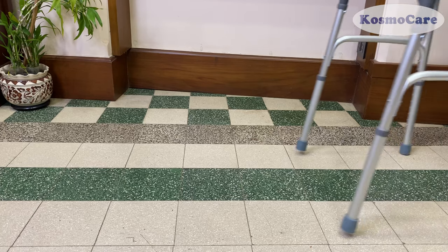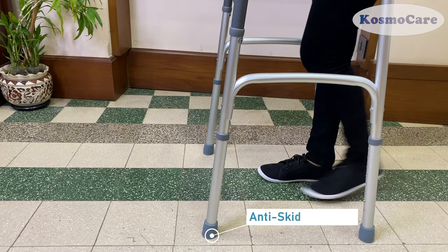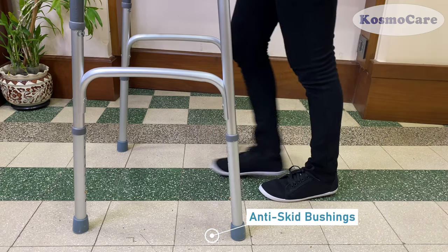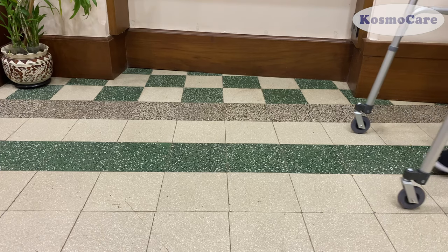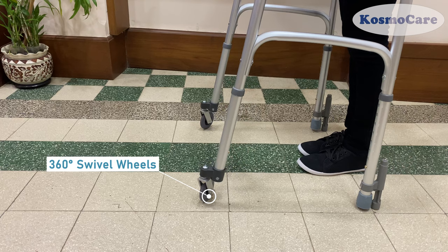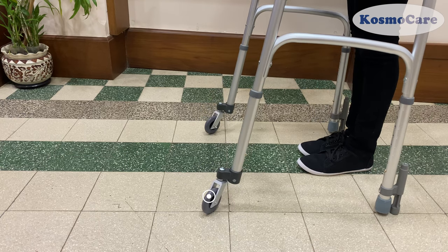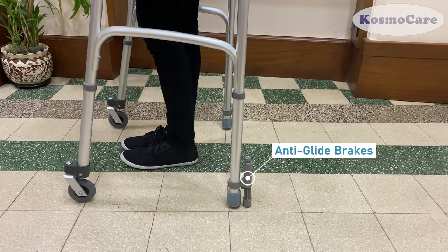Included are two sets of attachments which can be used interchangeably indoors and outdoors. One set features forelegs with anti-skid rubber tips, and the other includes swivel wheels which enables the user to maneuver the walker effortlessly without having to lift it, and anti-glide brakes for added safety.